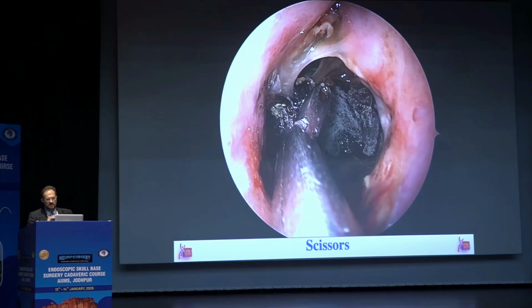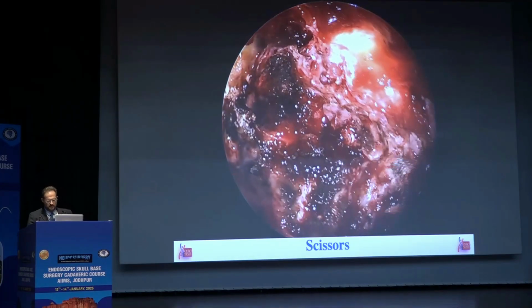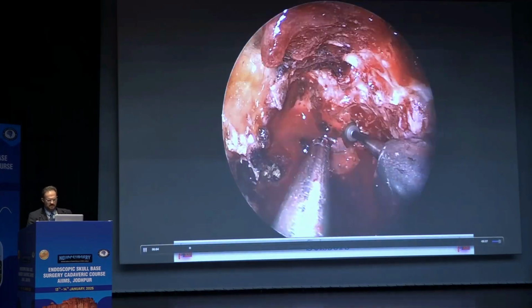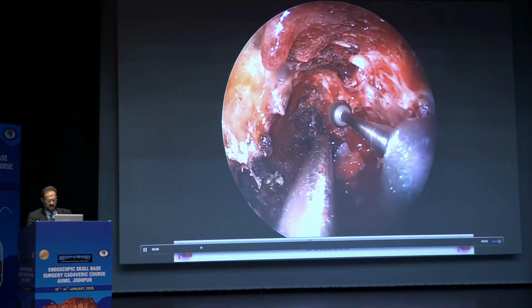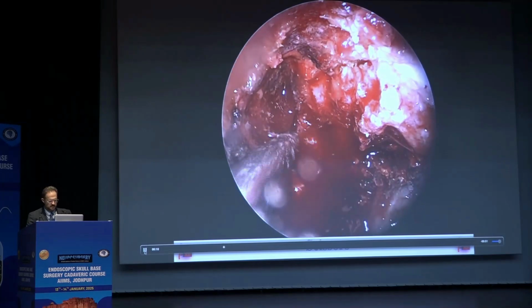Most of these are gifts, people who donated them for education. I'm not going to say names or where they come from, but the idea is to learn from the mistakes of other surgeons. So this is a somewhat rough technique, as you can see here, like drilling the soft tissue. So I'll put a little pause.